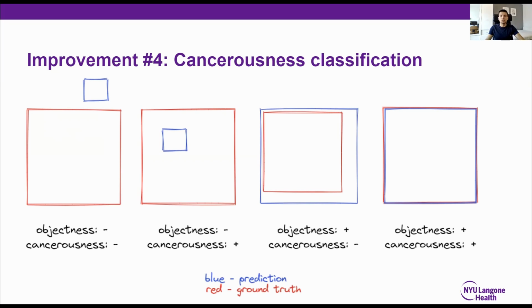This means that the model tries to detect whether the object in the box is the whole cancer lesion. However, since small parts of a lesion are still a lesion, punishing such small box predictions might confuse the model. We mitigate this by introducing a second classification goal we call cancerousness. The main idea in this separate head is to reward all boxes that highlight smaller parts of lesions.